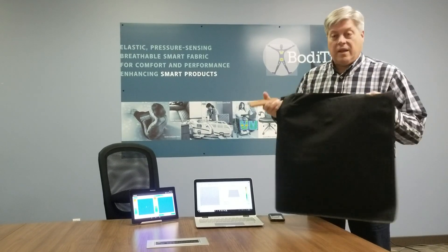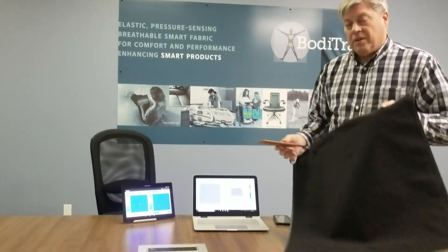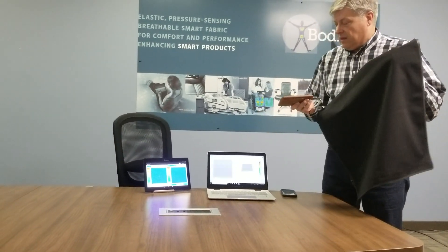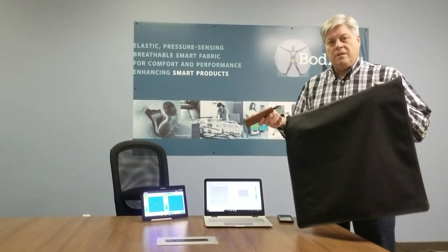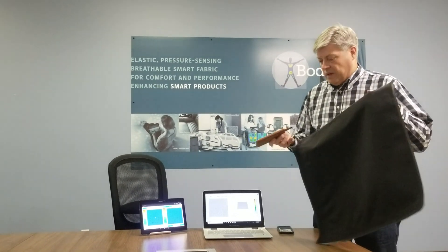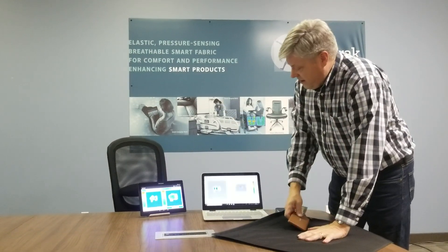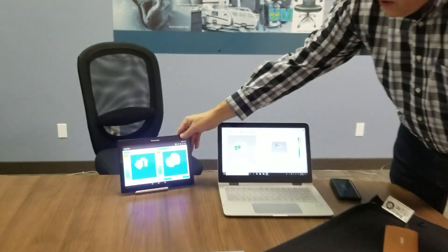I've already done that for both the tablet on the right and the desktop here. The tablet's running BodyTrack Lite and the notebook here is running BodyTrack Pro. And as I put a load on it, you can see that that load shows up.